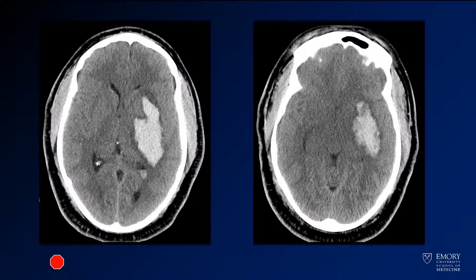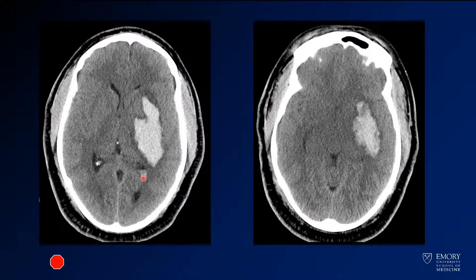What you see is some axial CT images through the level of the basal ganglia. There's a big hemorrhage here on the left. It's involving both the putamen and the thalamus, essentially eradicating the posterior limb of the internal capsule. There is also a little bit of intraventricular hemorrhage, and this is extending adjacent.